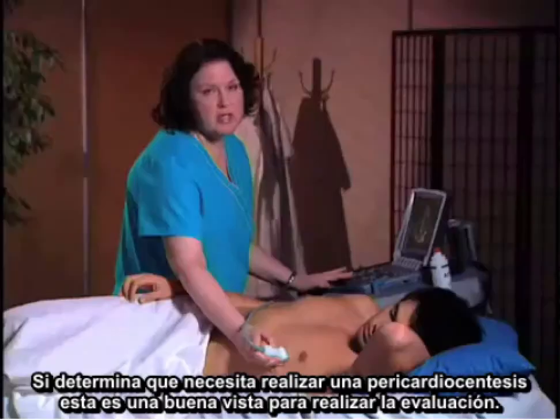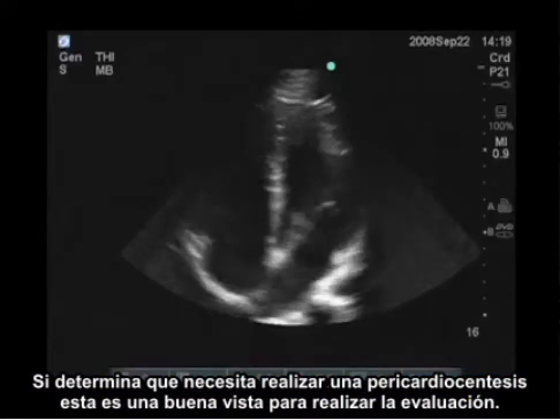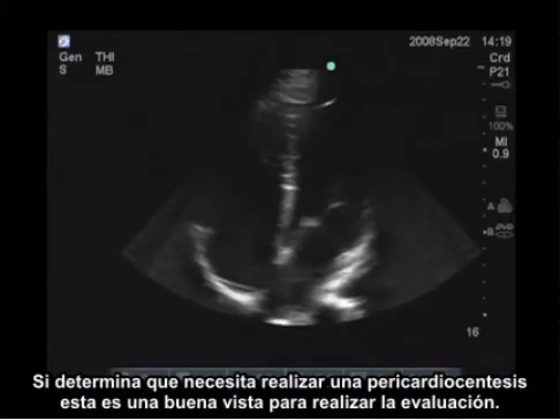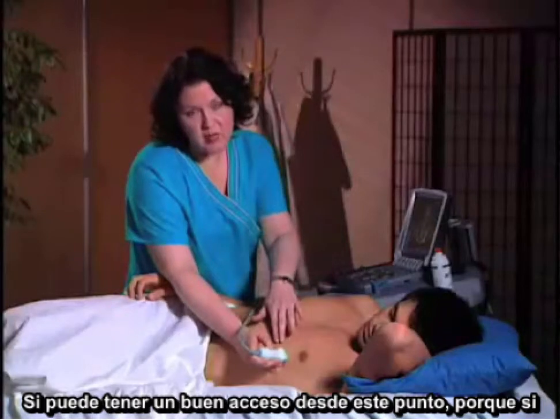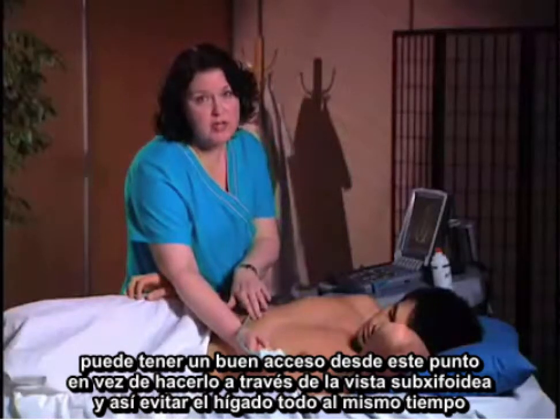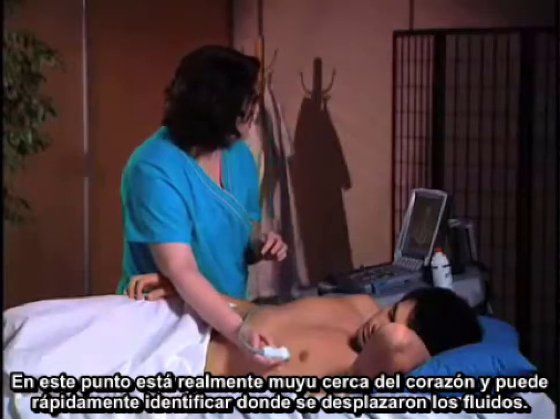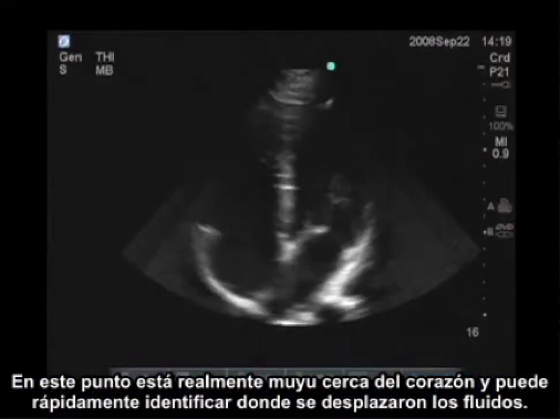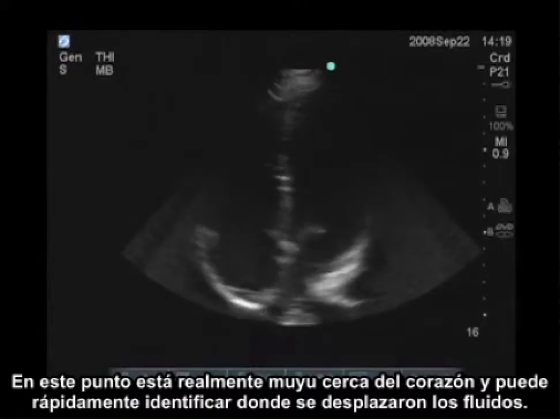If you've determined that you need to do a pericardiocentesis, this is a good view to evaluate if you can get good access from this point. Because if you can get access from here instead of going through the sub-xiphoid approach, you avoid the liver altogether. At this point, you're very close to the heart and can quickly identify where the fluid is and draw it out.